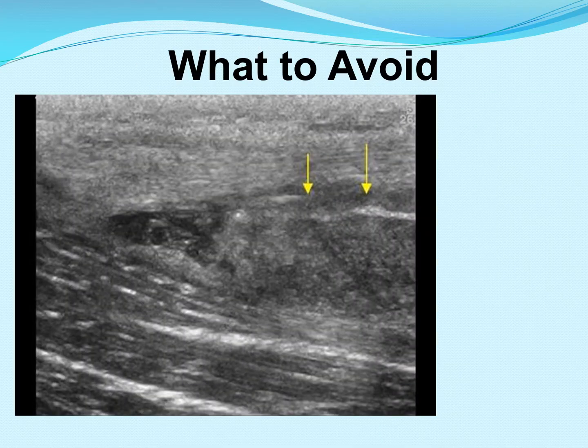What do we avoid? The nerve fibers. You want to avoid those nerve fibers because this is going to cause neuropathy-like symptoms that your patient will explain. They're going to say that they're in a lot of pain, it feels like it's burning, electric, sharp, shooting up my arm. They will not be able to tolerate the procedure. So try to avoid these structures if possible. If not, try to administer as much lidocaine as you can that's appropriate to dosing.